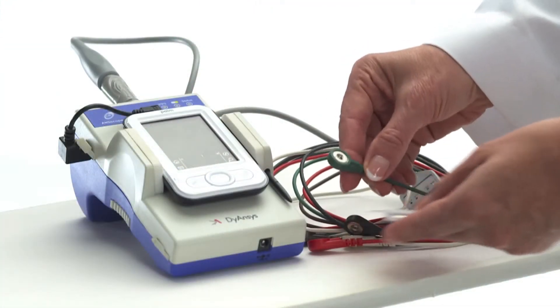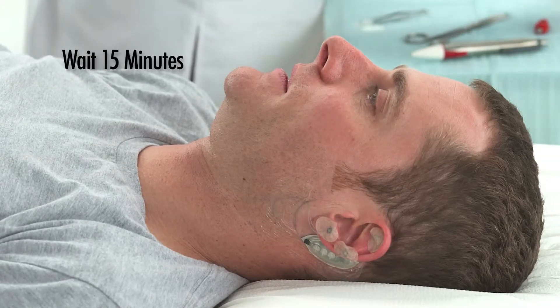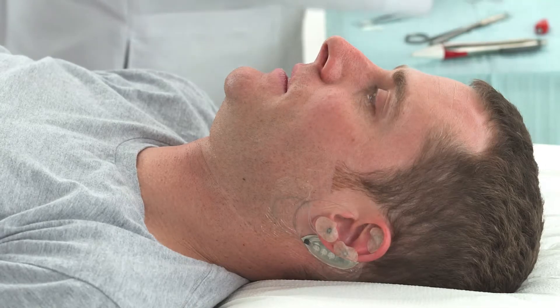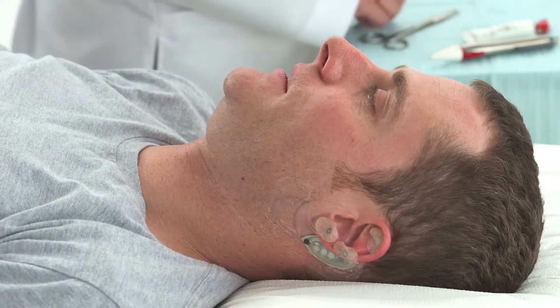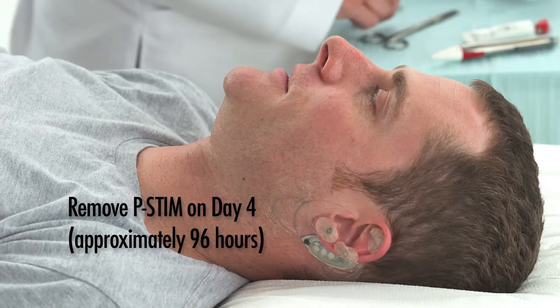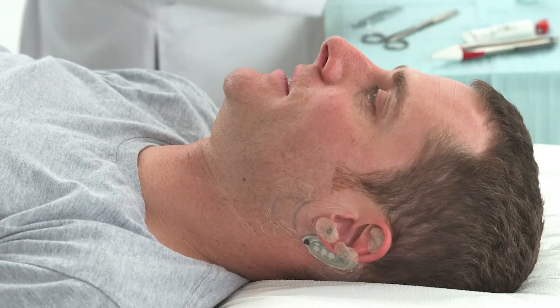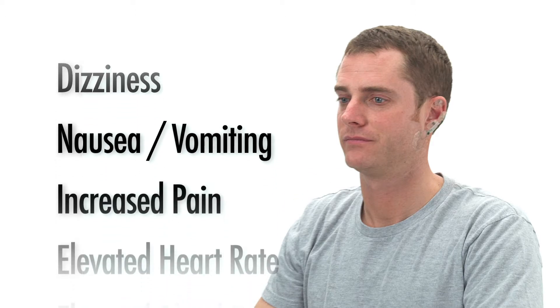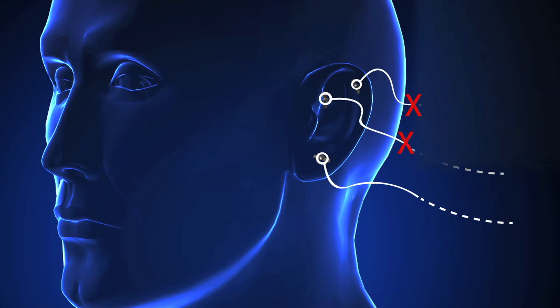Remove the electrodes and turn off the Anciscope to save battery life. Step 8 Final Patient Instructions: Have the patient wait at least 15 minutes to assure they are pain-free and not experiencing excessive discomfort. Remind the patient not to wash their hair and keep the device dry while bathing. Tell the patient exactly when to remove the device — this should be four days after placement. There are virtually no side effects from p-STEM treatment. However, some patients may experience adverse symptoms from overstimulation, including dizziness, nausea or vomiting, increased pain, elevated heart rate and/or blood pressure, and excessive perspiration. To reduce overstimulation, remove one or two of the needles — the patient can do this without an office visit by simply cutting the wire to the needles.